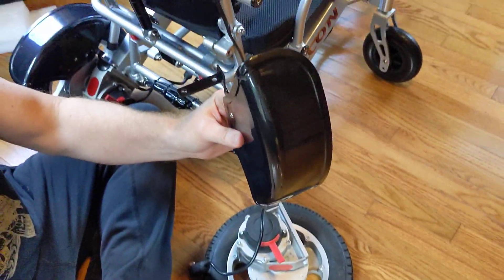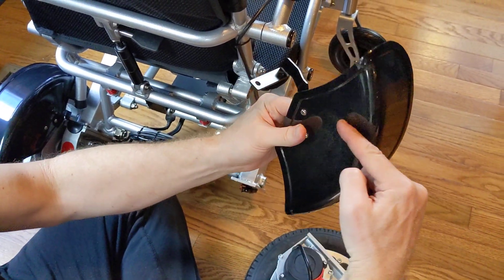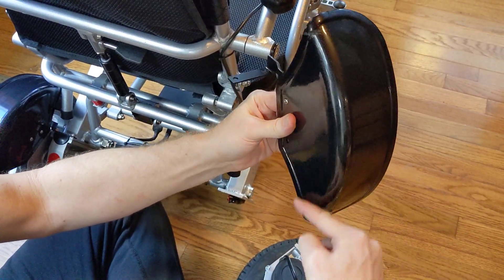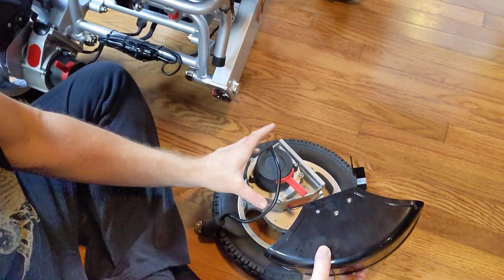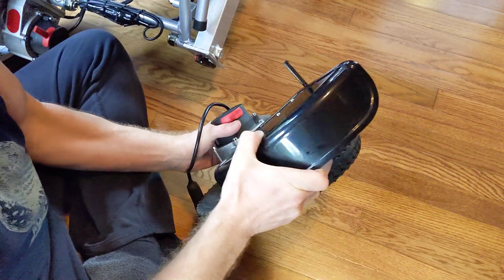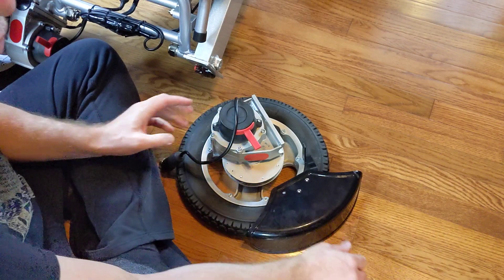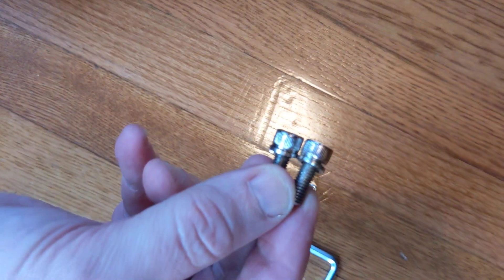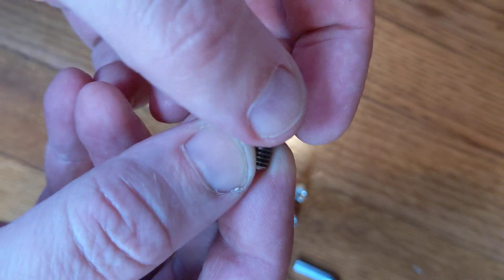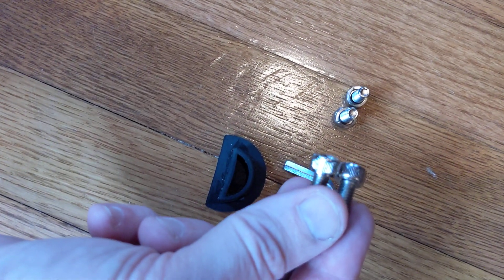The way to get the fender oriented correctly is easy — this part always faces the chair, and you should have more length below the fender and shorter on top. You should have two screws with a spacer — those two go in the front. Then the other two don't have a spacer — they go in the back.